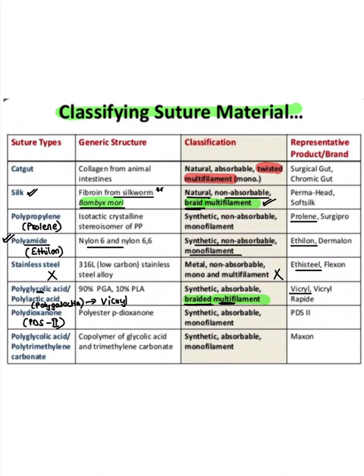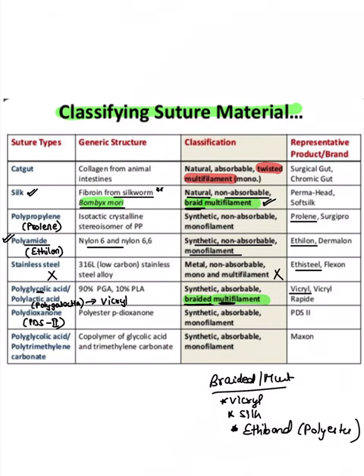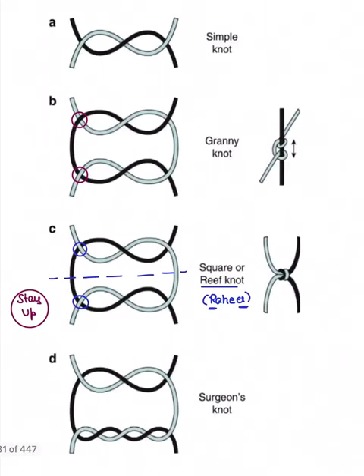Now see, what are the braided sutures, guys? So braided or multifilament sutures, recall for me, guys. Okay, so one is Vicryl, that is like a multivitamin tablet. Then it is the silk, where you need multiple silkworms, and the other is the Ethibond, where there is a bond on Easter, people make a bond, that is the Ethibond. So these are the only braided sutures, the rest are all monofilament sutures, guys. No more confusion now. I think this shorts the topic of suture material forever.